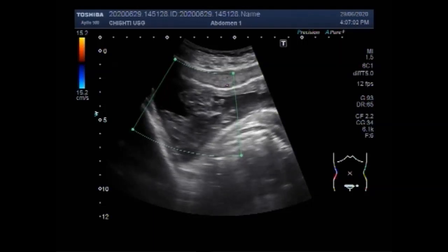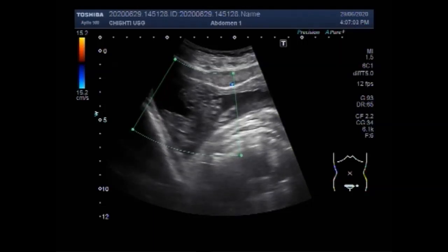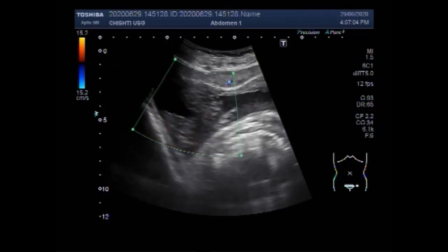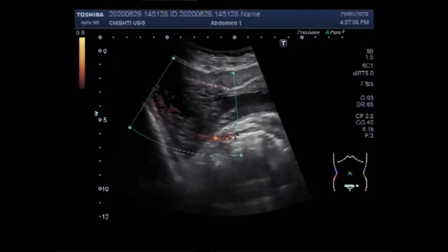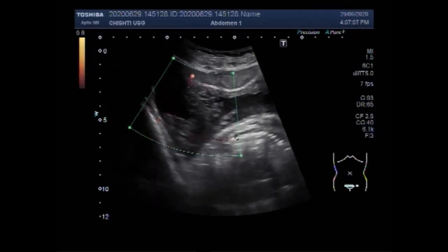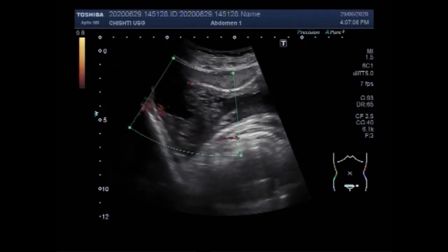Now you can see the blood flow. A significant blood flow is seen inside the growth.